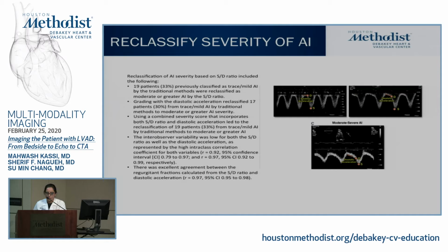So the question is whether we could incorporate this into our echo results. I think it would be meaningful, but the only problem that I see with that is the outflow cannula Doppler imaging is hard. And a lot of times I don't see good enough images of the outflow graft. Although I also think that we don't get the right views for the outflow graft. So that's one other important piece of information there.